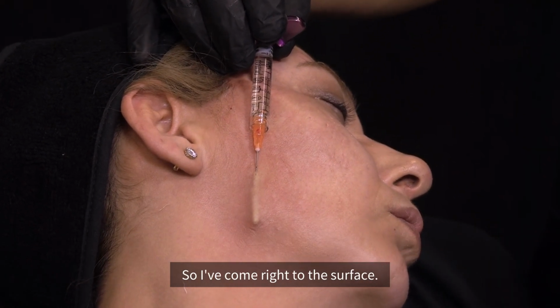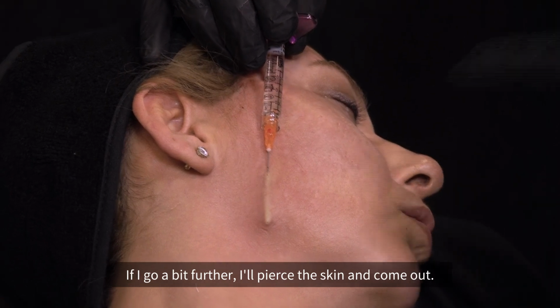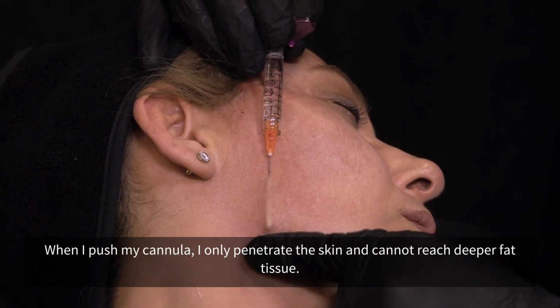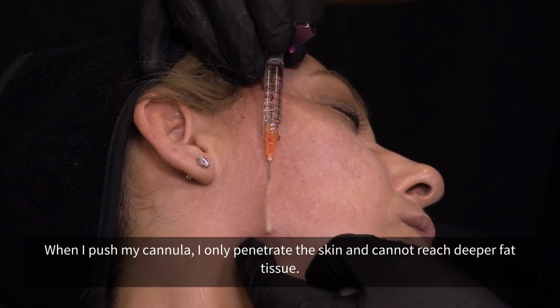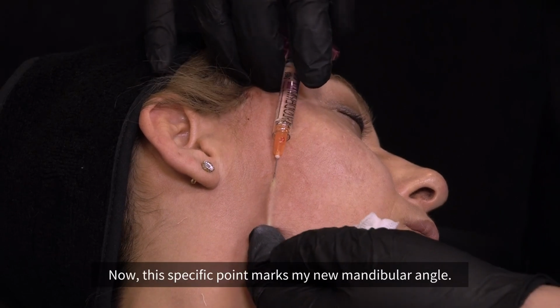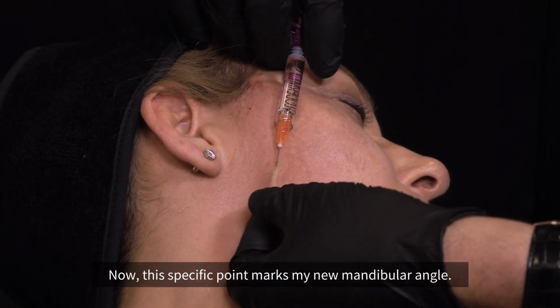So I've come right to the surface. If I go a bit further, I'll pierce the skin and come out. When I push my cannula, I only penetrate the skin and cannot reach deeper fat tissue. Look, my mandibular angle is still here and I'm higher up. Now, this specific point marks my new mandibular angle.